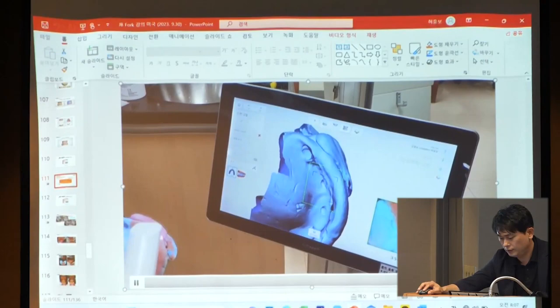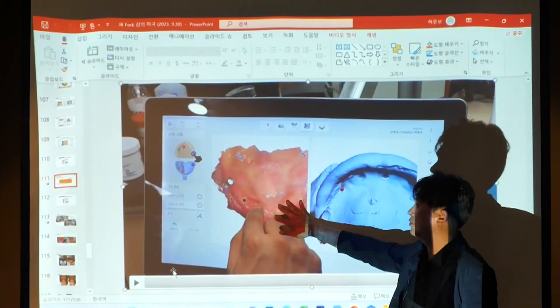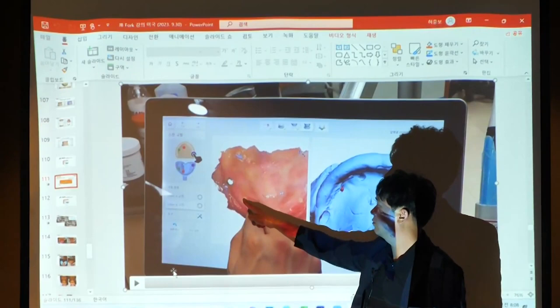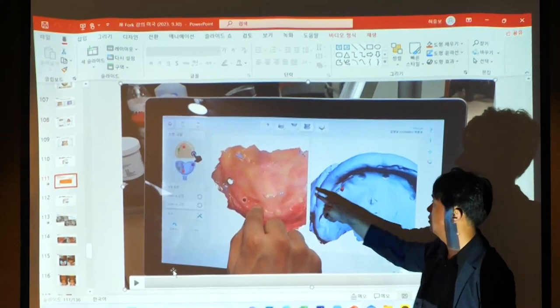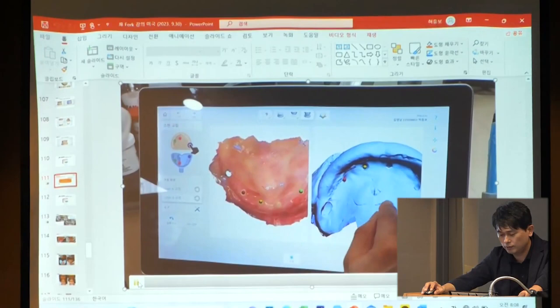After finishing the scan of the JB impression, look at this. This is the upper and lower impression scan, and then this is the JB scan. So you can indicate the same place, red mark, touch, and the same place, touch, touch, touch. And 3 points are enough. Look at this, and then second, it automatically merges like this. Can you see that?